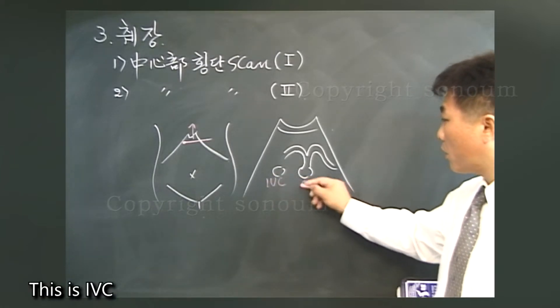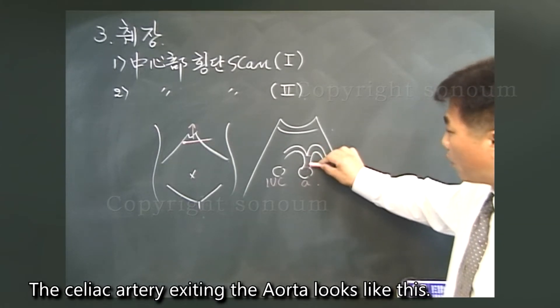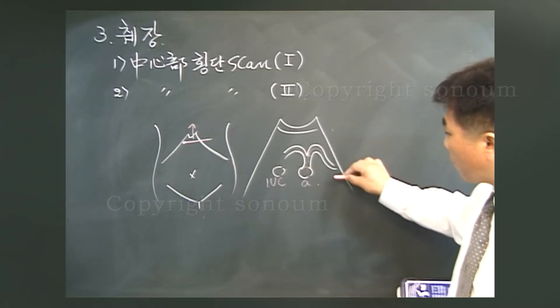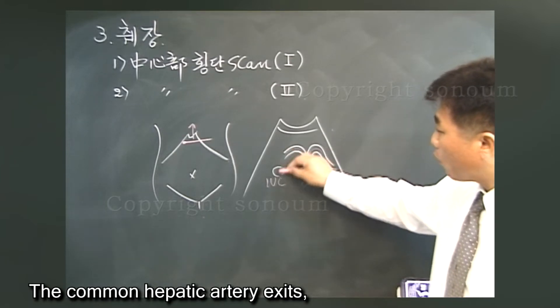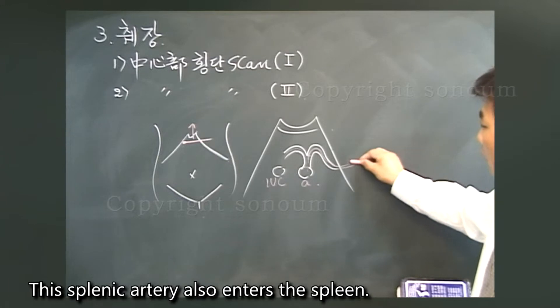This is the IVC. This is the aorta. The celiac artery exiting the aorta looks like a seagull sign. The common hepatic artery exits, and the splenic artery exits. This splenic artery also enters the spleen.